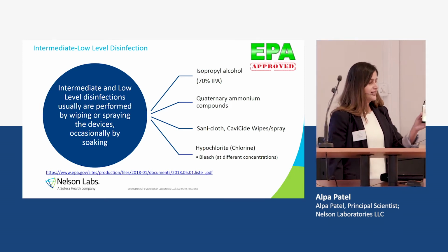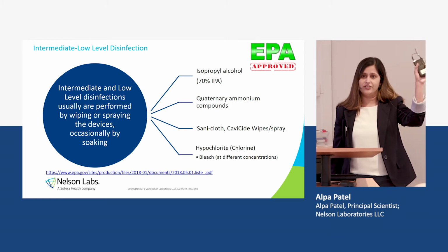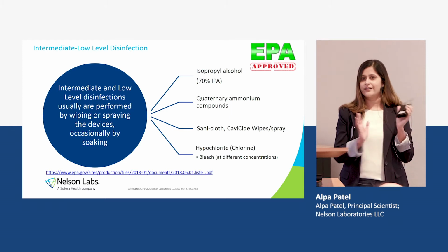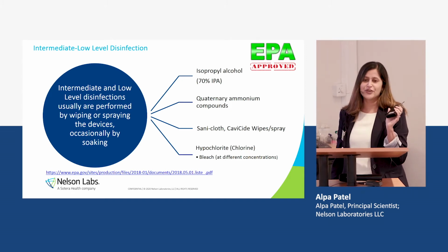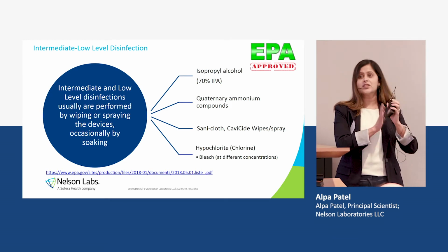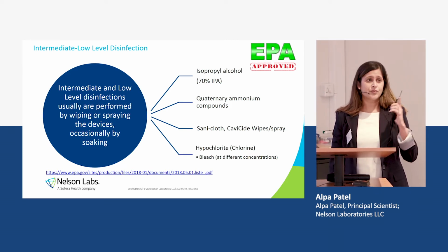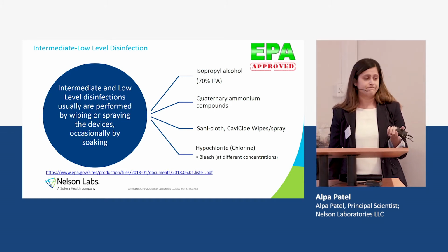So I'm touching it, patient contact. I put 1 million bacteria in here. Now I have to wipe. How is the hospital going to wipe? Done, next patient. I can't do that. It's not going to work. We're not going to get a 6-log reduction by just doing that. So we're going to be doing a validation where it's going to take much more than that. I'll have to either wipe it a couple of times, have a wiping action, removal, and that's how we're going to validate it.